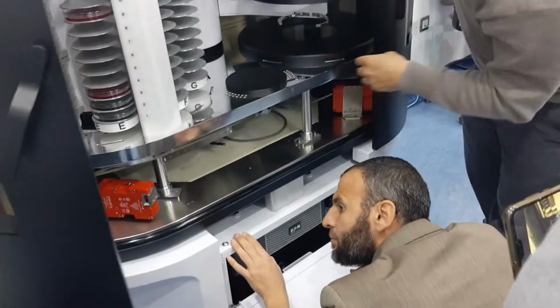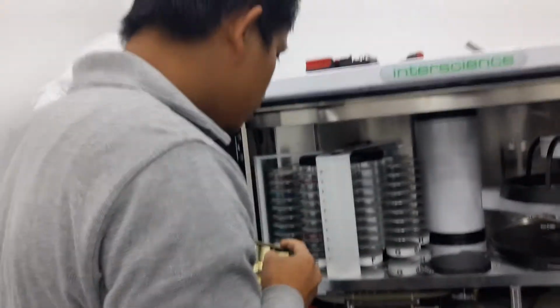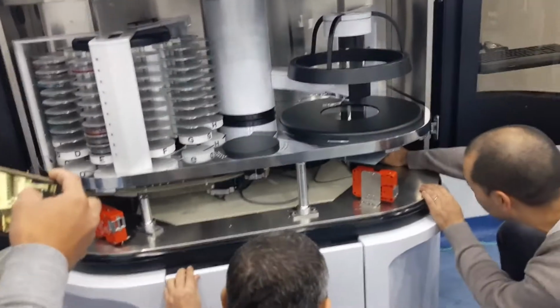It's working, but yeah, it's alright. Okay. What can we do? Maybe I can show you there.